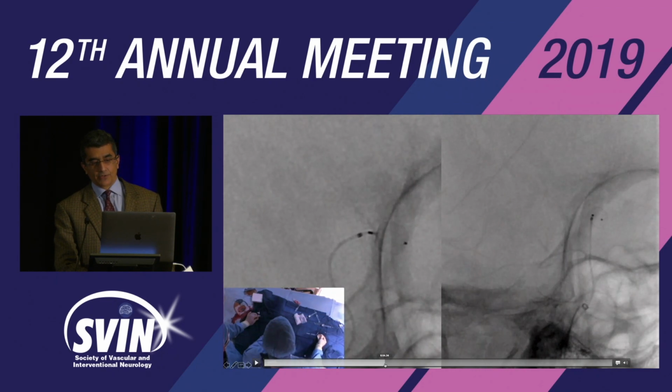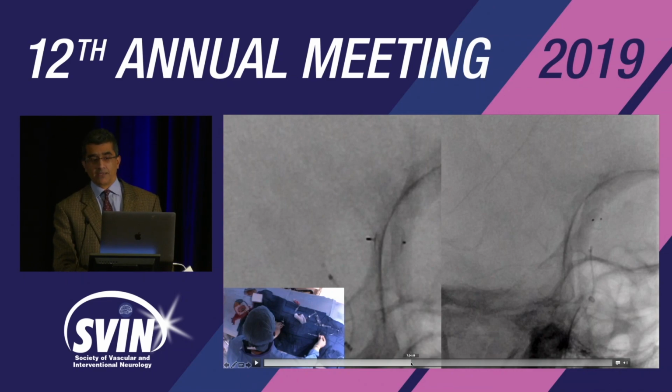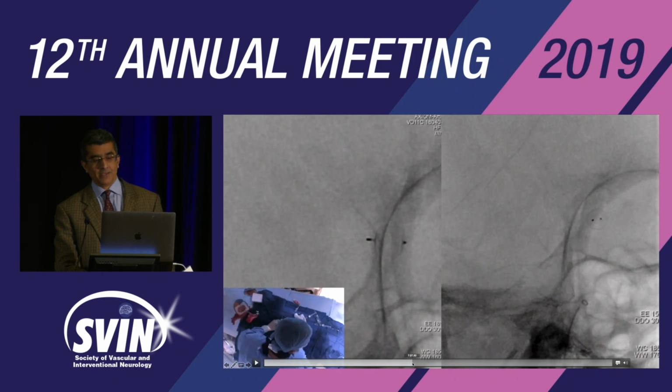The microcatheter is advanced back to the detachment marker on the WEB device. In this case, we had a little bit of a sticky detachment. We did flush the microcatheter, which helped bring the microcatheter back and detach the device. And you can see as the microcatheter comes back, the device will settle down inferiorly towards where we thought there was a little space. The microcatheter is removed.